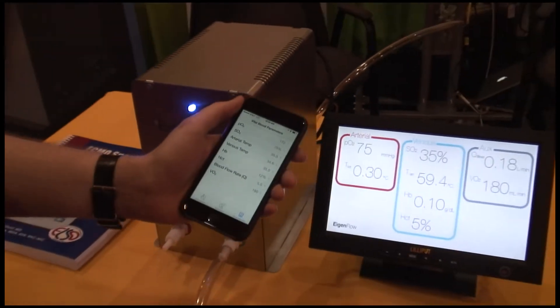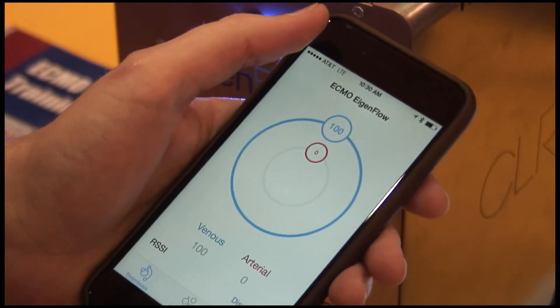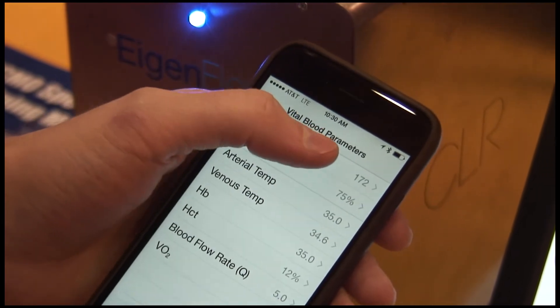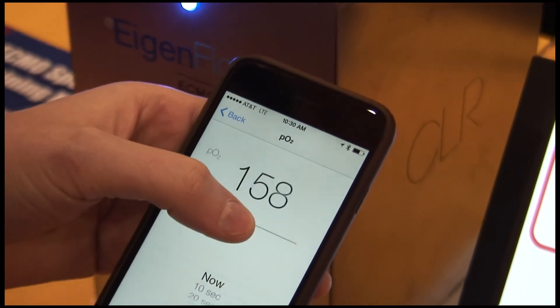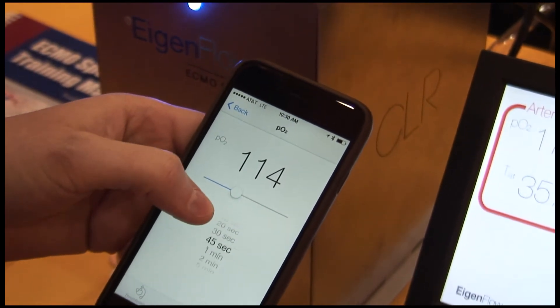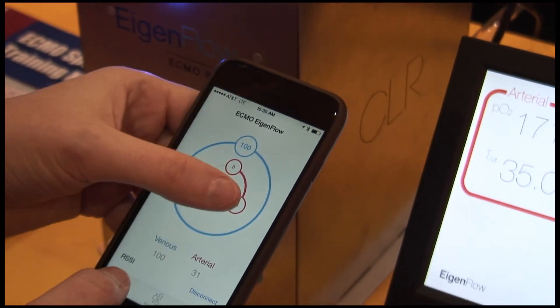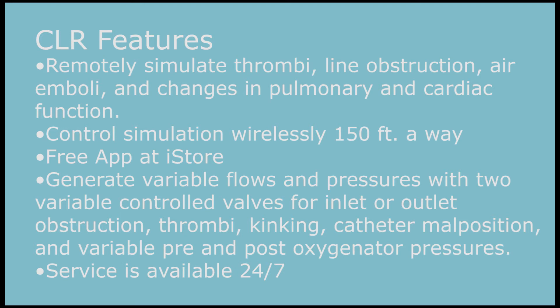Finally we have the blood monitor, which controls all the values on the screen that you see up front. We can move up to 170 PO2, select that, and actually change the value that you want — you can trend it over time. Once you move back it gets updated to the display. Everything is done wirelessly and it goes up to 150 feet through Bluetooth.